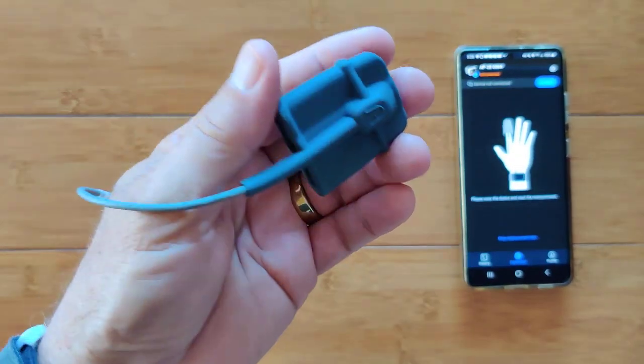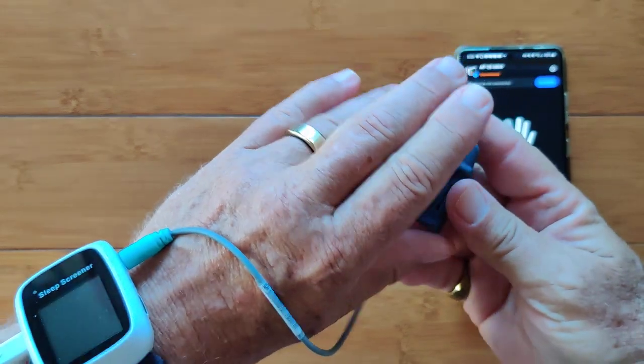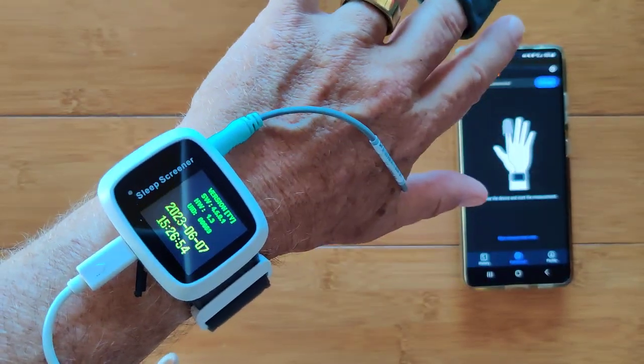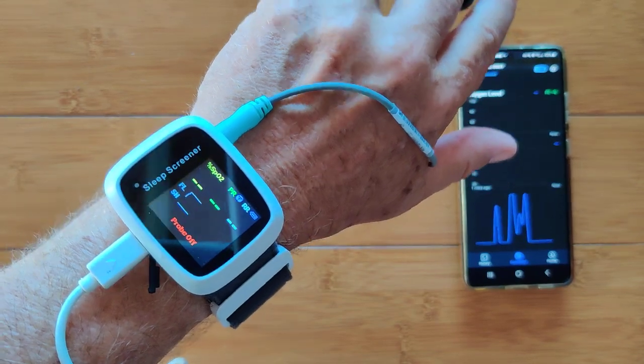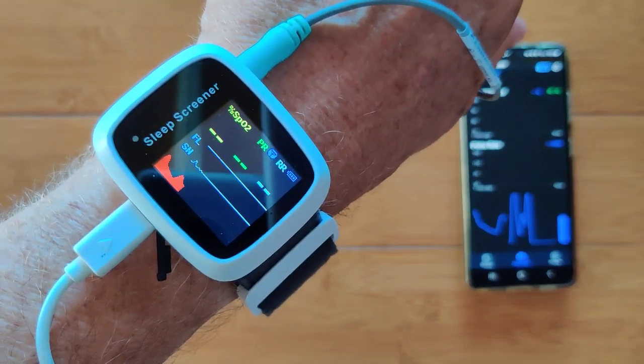This is the ViBeat AP20. It is a blood oxygen monitoring device that as soon as you stick it on your finger will activate it and start reading both your blood oxygen and your heart rate, or pulse rate, as they talk about it here.